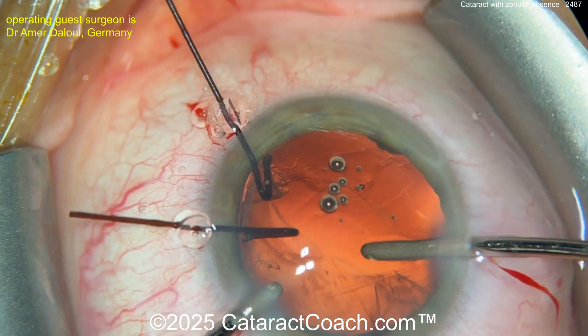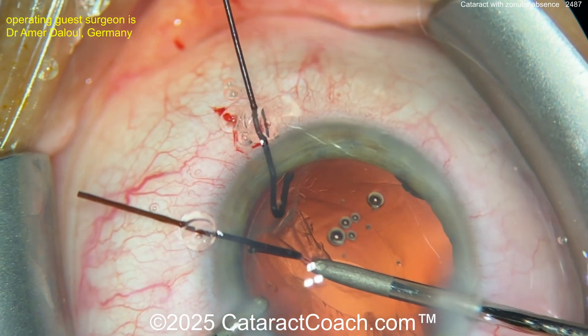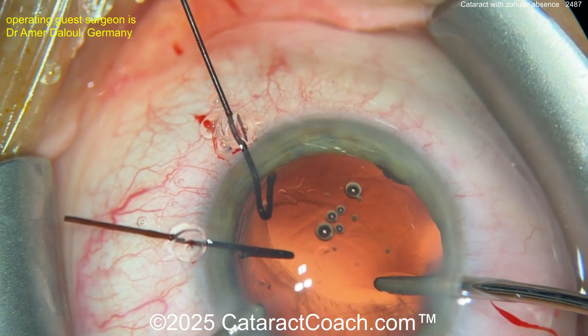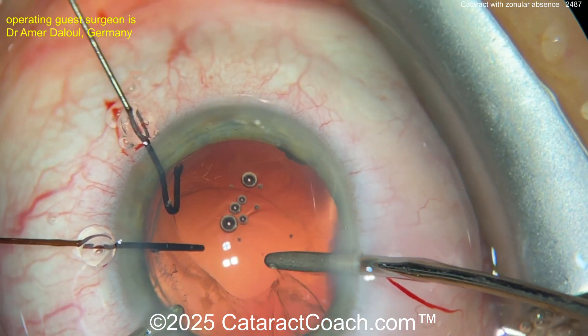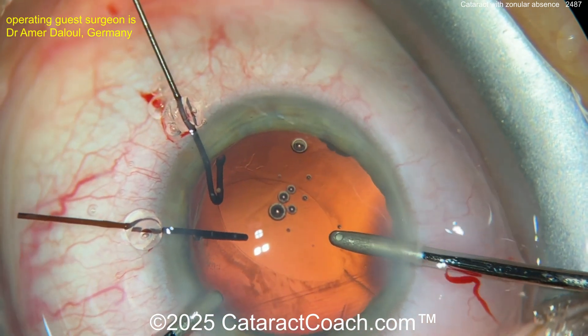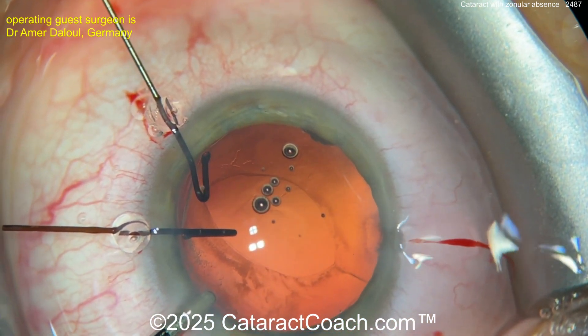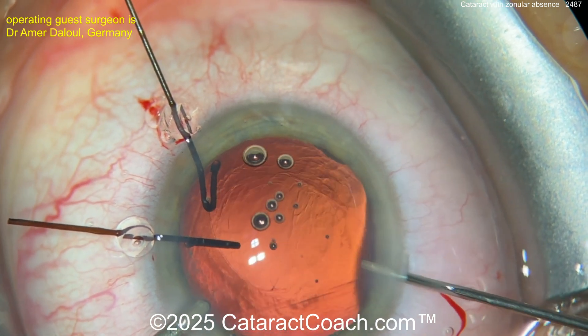Taking your time here. Make sure there's no prolapsed vitreous as well — in a case like this, maybe put a little triamcinolone inside the eye to see if it stains any vitreous. You may want to switch hands again or use the infusion line to stabilize the capsule. Looking pretty good — viscoelastic is your friend here. Turn off the infusion and come out.